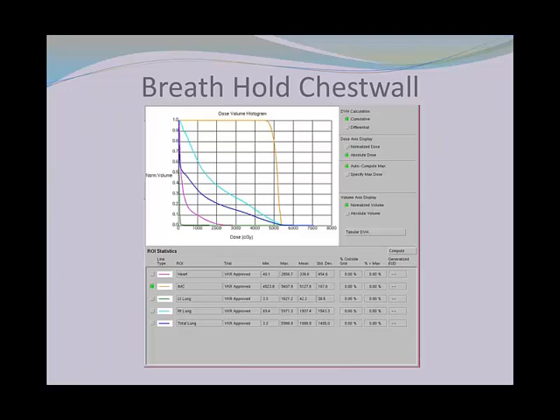But the thing is, we can't really lower the inferior border of the supraclavicular field because that would increase the dose to the lung. And so we thought about maybe angling the non-divergent border.